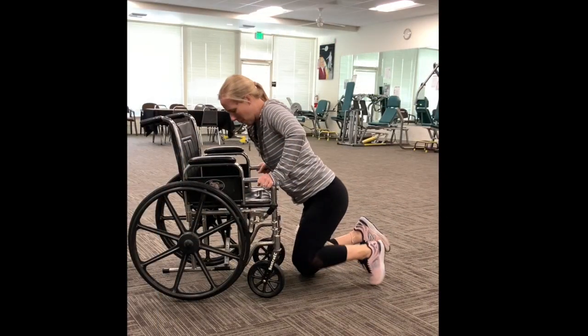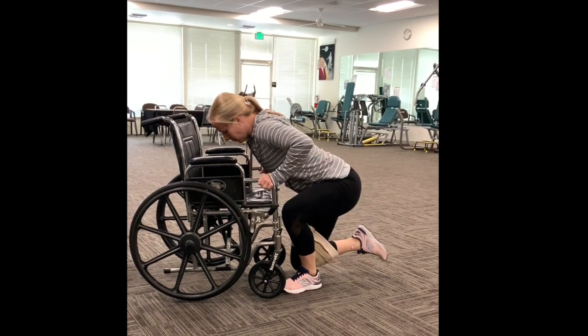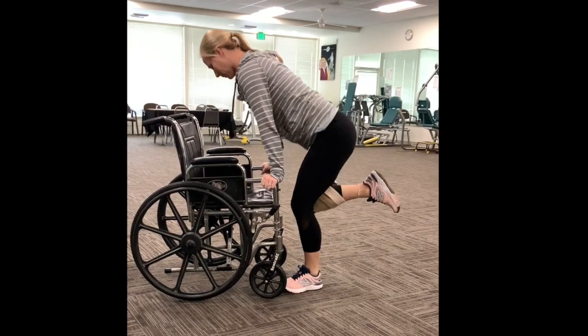Next, the patient will flex their knee and hip in the sound limb and use the residual limb as support to push up and get into a half-kneeling position. Lastly, the patient will use their strength in the sound limb to completely stand up and pivot their body towards the residual limb side until the chair is behind them. They will then use the strength in their sound limb to control the descent into the wheelchair.